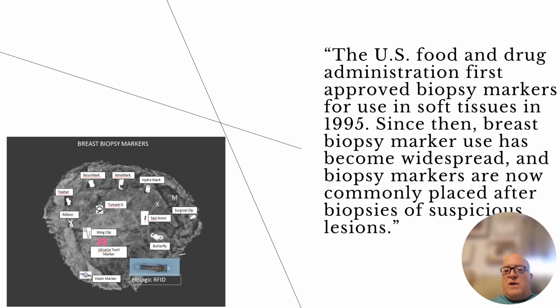And these markers are what we look for and identify and make associations with on a daily basis with these breast cancer cases. This is one of our biggest challenges as a PA, along with lymph node dissections and complicated cases. These markers we have to identify and talk about their associations, and they're very small. I'm talking like 2 millimeter, 1 to 2 millimeter markers.